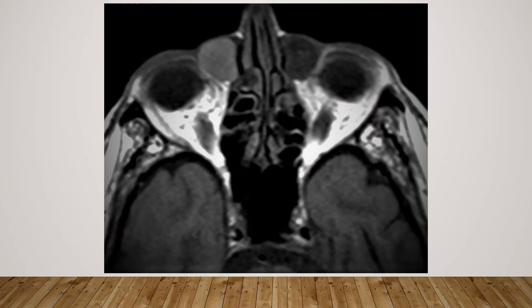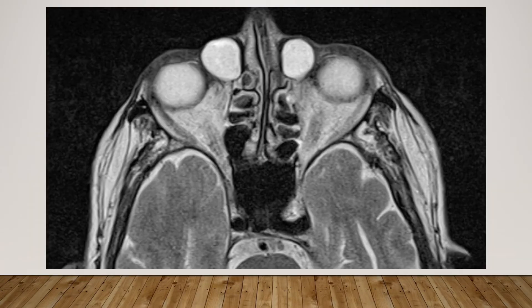Here is the T1-weighted image. As you can see, there are low signal intensity lesions near the medial canthi of both eyes. The lesion on the left is slightly more hypointense than the lesion on the right. On the T2-weighted image, the same findings are replicated — this is the hyperintense lesion on the left and this is the hyperintense lesion on the right, both situated near the medial canthi of both eyes.